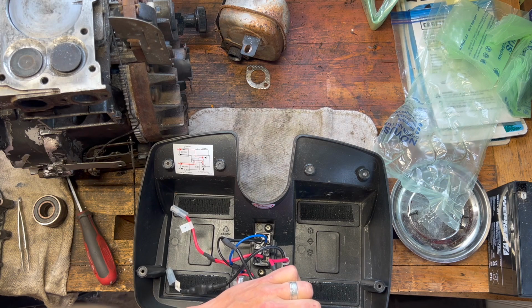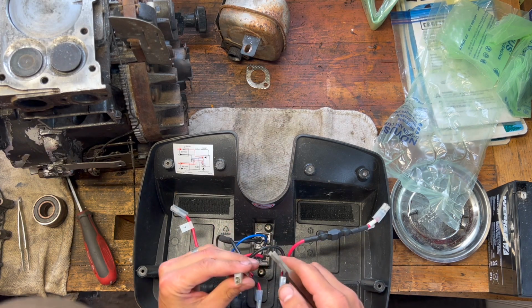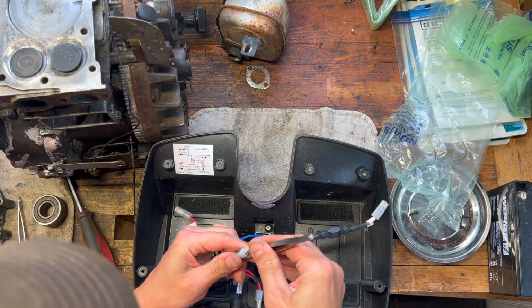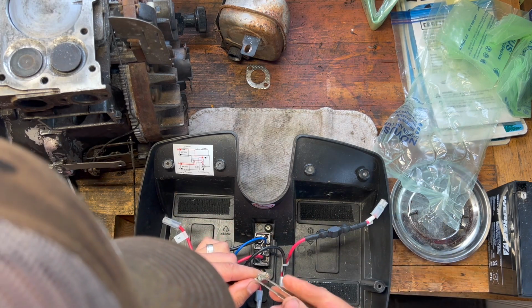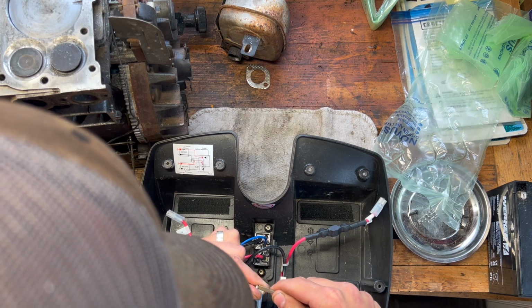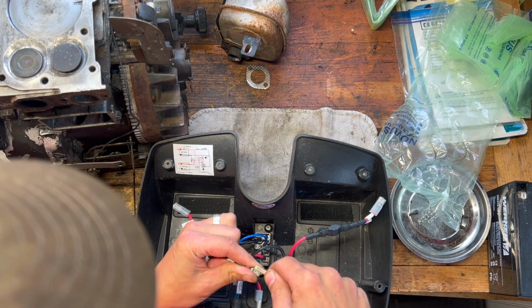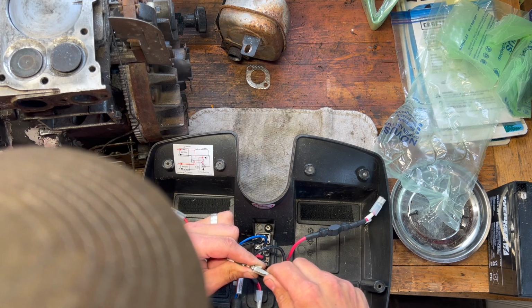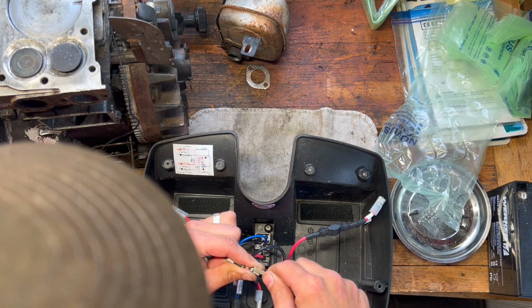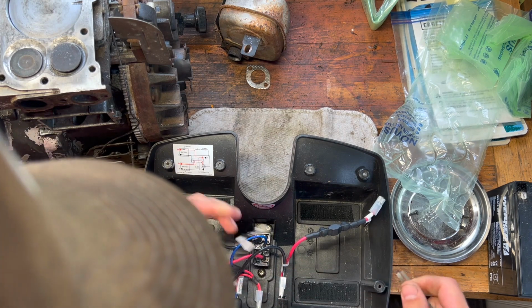So I figured if I was going to get a mower battery for testing, then I may as well just get the right batteries. And if that's not the problem, we'll figure it out later. But at least at this rate, if we can confirm that we're getting power out and that the batteries are taking a charge, then we can get this all sealed up and we know that this is working good. And then we can move on to the actual machine.